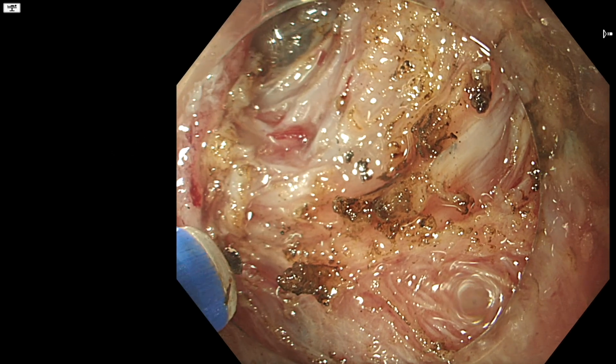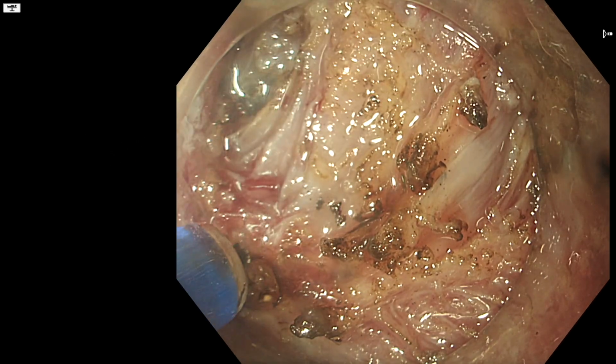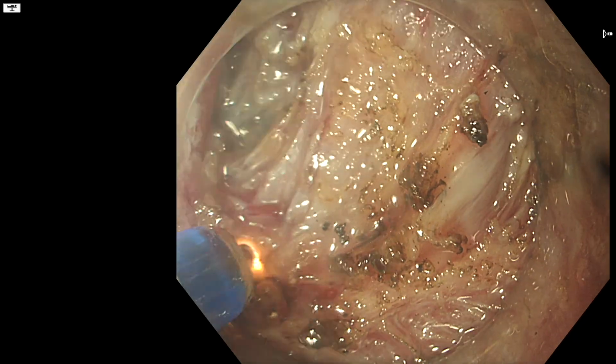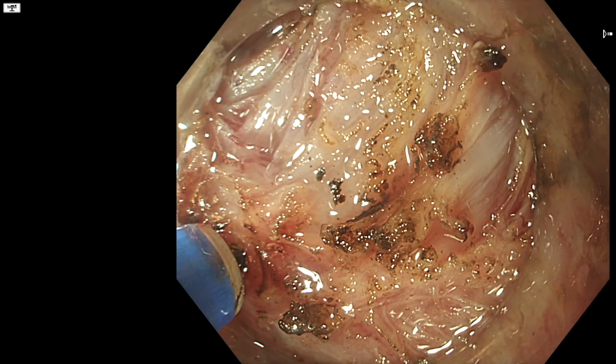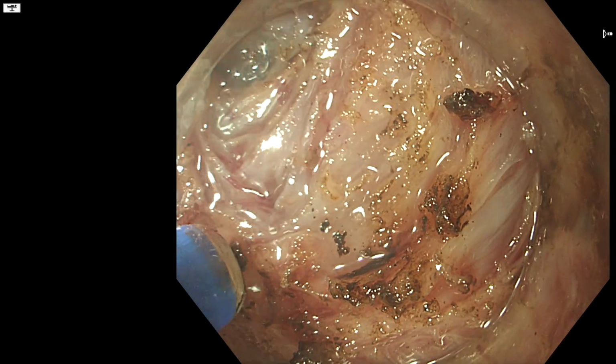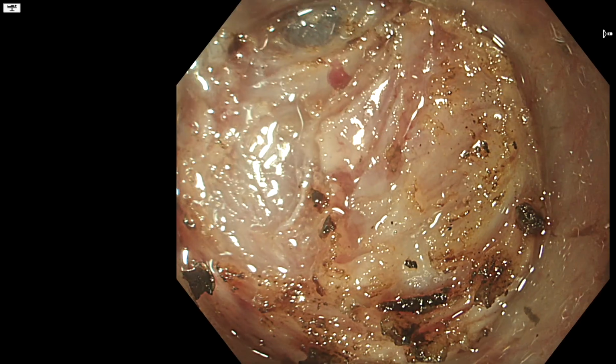Now, because we hadn't separated this area so well from beneath, the IT2 knife was actually hindering more than helping us at this point. So we switched back to the Pro knife, in order to cut all the circular muscle here.